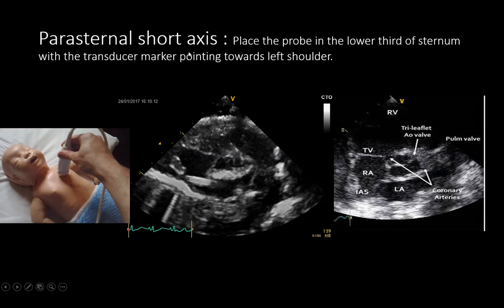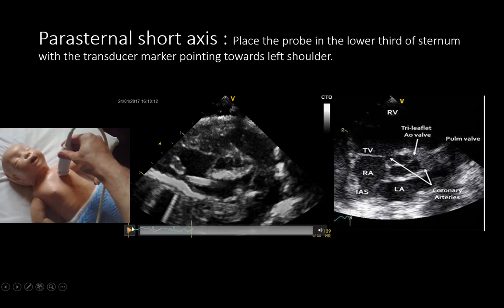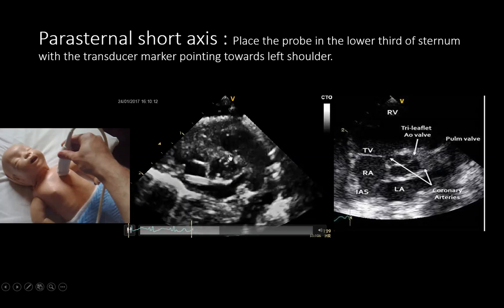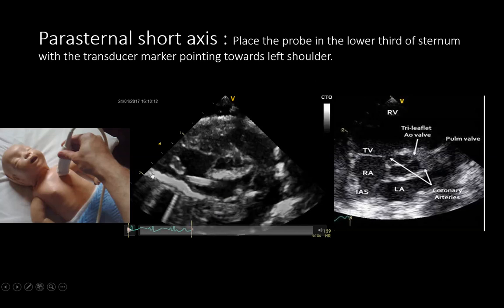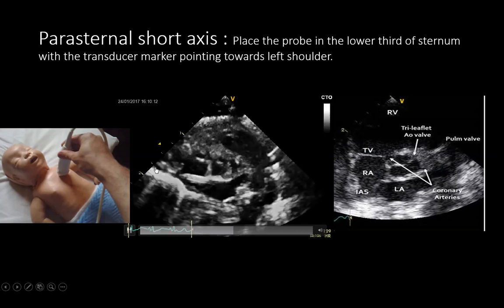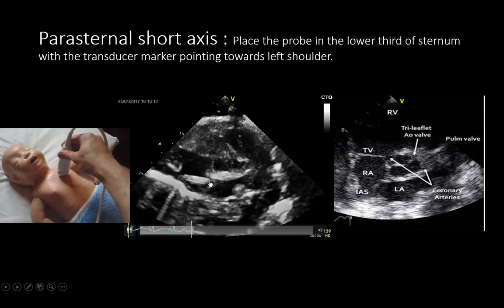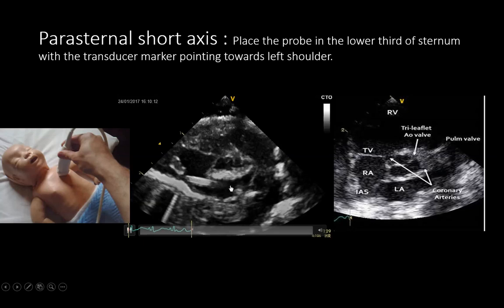To perform the parasternal short axis view, the probe is placed at the lower one-third of the sternum with the transducer marker pointing towards the left shoulder. In this view you see the aortic valve at the center, the left atrium posteriorly, and the right atrium on the right. You can visualize the catheter tip coming from the IVC into the right atrium, and assess whether it is crossing the patent foramen ovale into the left atrium.